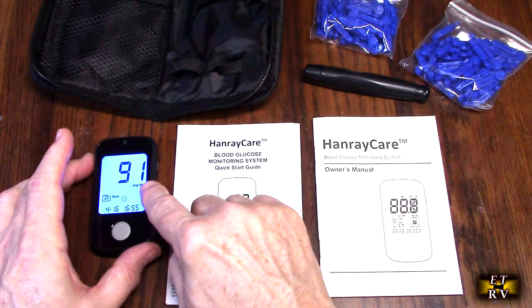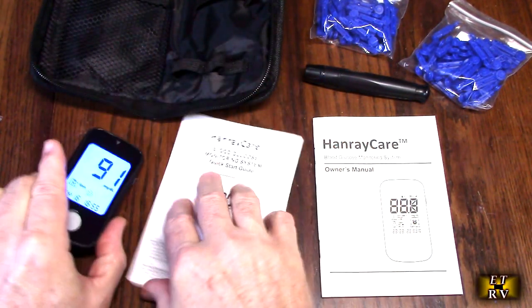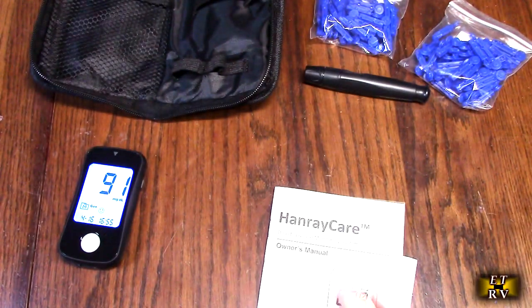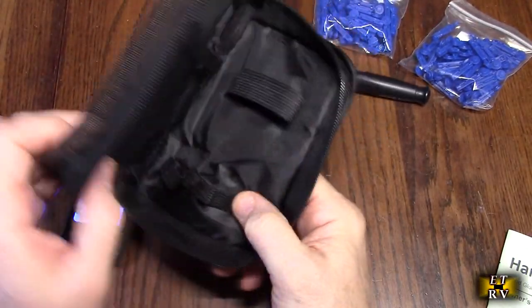It's showing me the last reading right there, so it has a memory to let you see what you've done before. The quick start guide and the full owner's manual are included, and it has this really nice holder so that you can bring it with you when you're traveling.